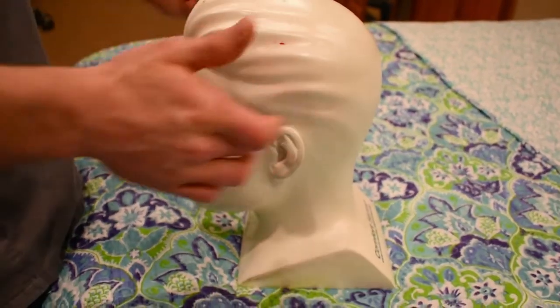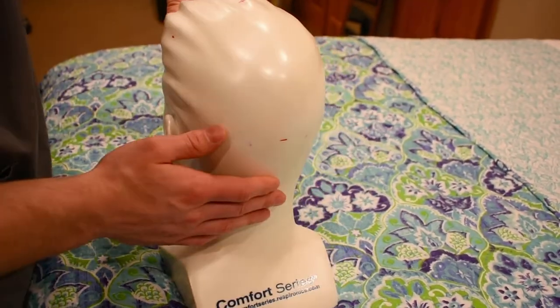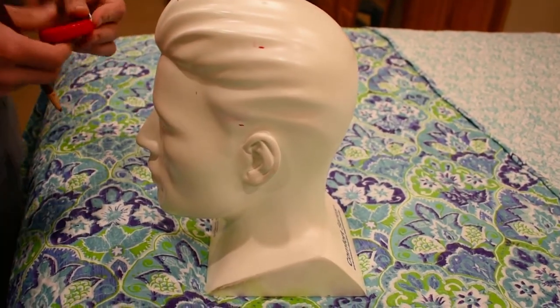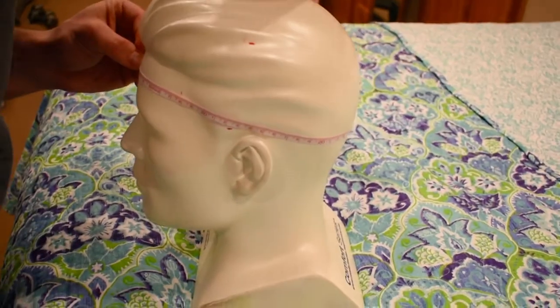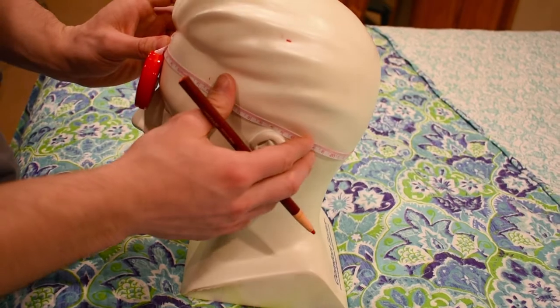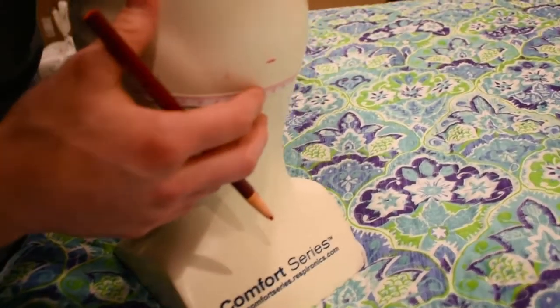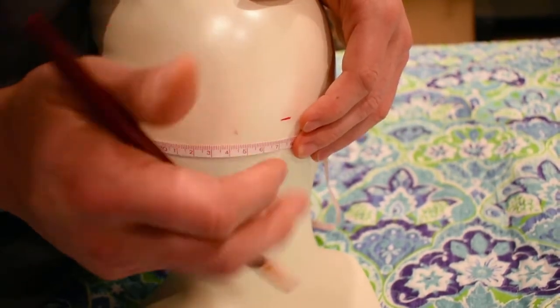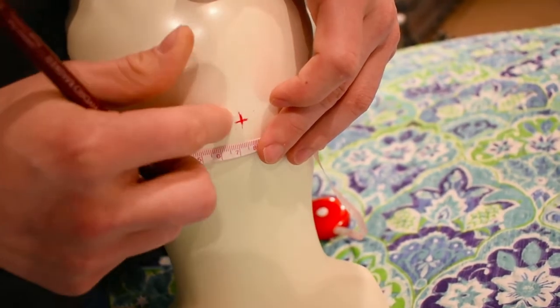Okay, so now that we have the entirety of the circumference of the head, which is 55 centimeters, we're going to find the last measurement to finalize OZ at the back of the head. So we're going to get the circumference of the head again, which was 55 centimeters. And then halfway, which is 27.5 centimeters, is going to be our mark where we're going to place OZ. So we're going to mark right here. It's right there. So that's our OZ.